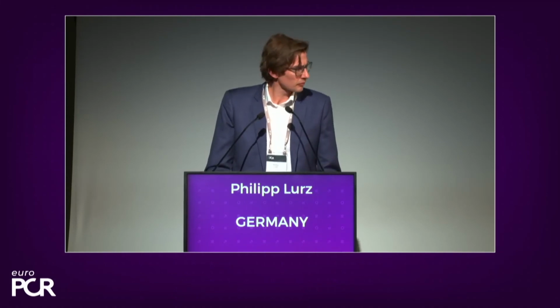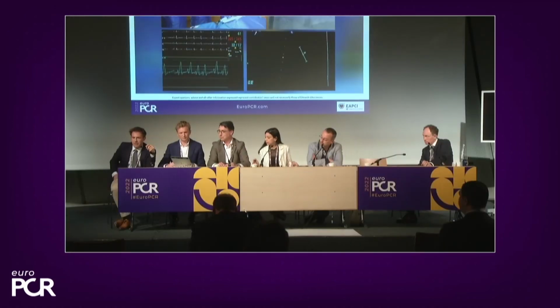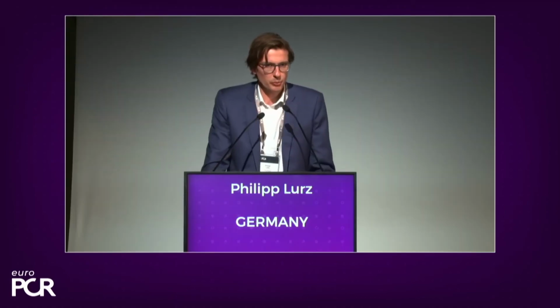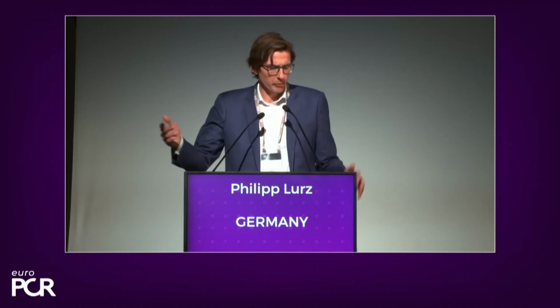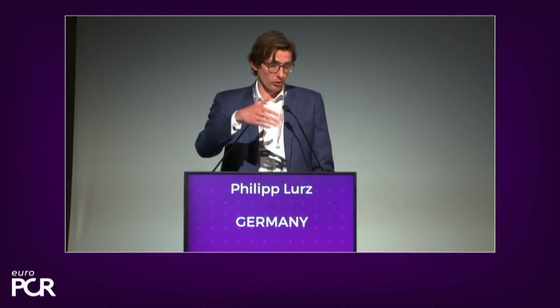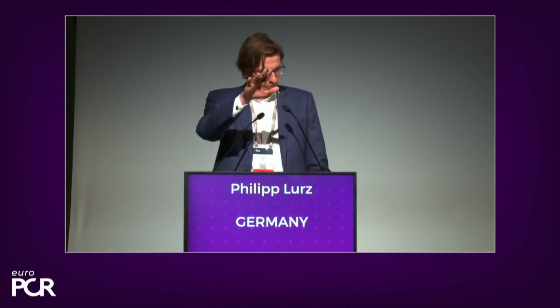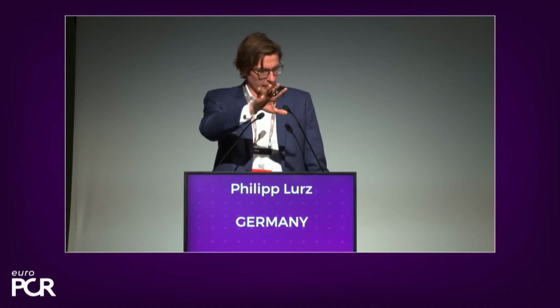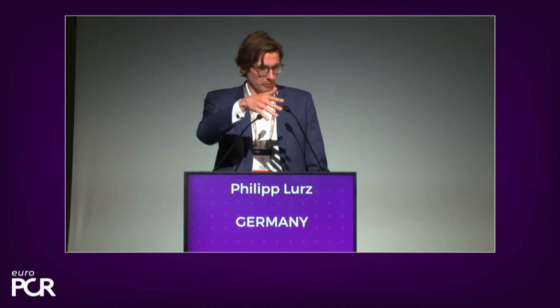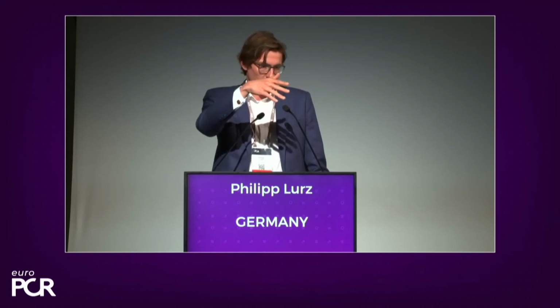And I think it's an amazing case. And we always discuss how important the transseptal puncture is. And what about it here? I think this is a particular scenario for that. Yes. So what we do more and more often, obviously we aim for a transseptal puncture about 4 centimeters, and we try to be posterior. But in more complex anatomies, what we normally add is we double check on a 3D and try to appreciate where we have the tenting and correlate that to the medial commissure. And with that device, you find it much easier and much more straightforward if you really enter the left atrium just above the medial commissure, and also for this case.